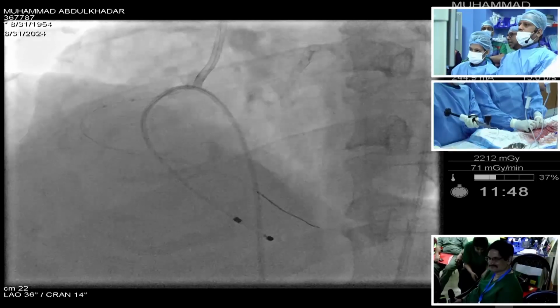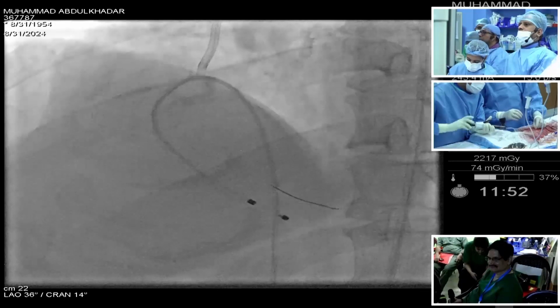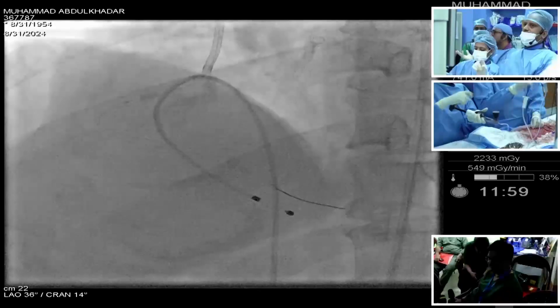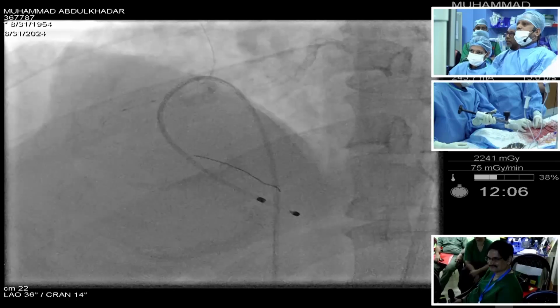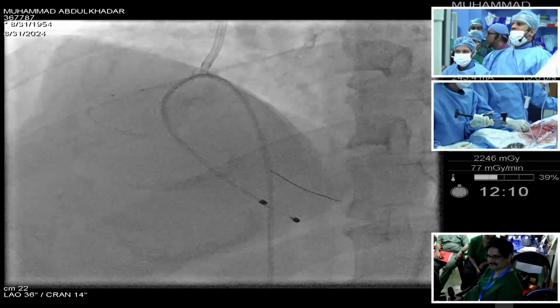A balloon based strategy depends on whatever you see post ablation on the OCT. Based on that, you could decide on the balloon based strategy. In a good center, seeing some amount of concentric calcification, they would prefer going in with an IVL balloon.